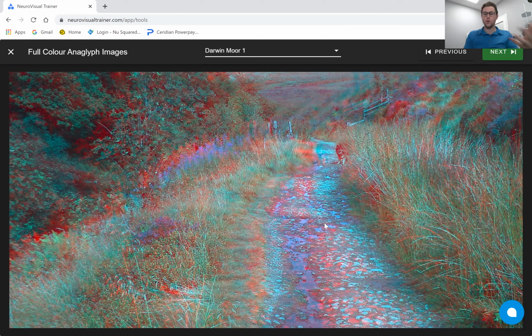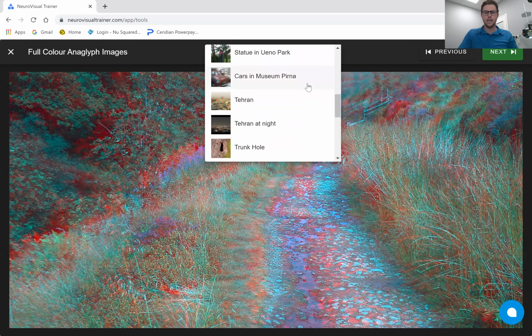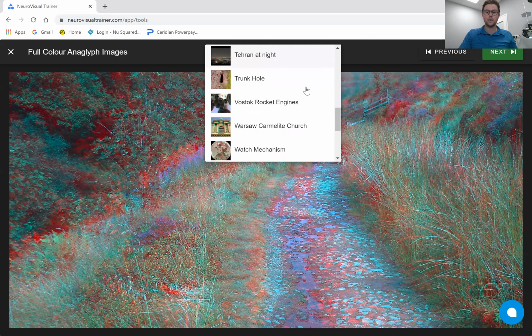What we'll often do is take this image and we can project it on a larger screen, and we might use it to teach the ability to look soft while taking in peripheral cues. And again, it's a way to just highlight the importance of the fusion between the two eyes to create the highest level of depth perception. Because you'll notice that as you're using it, it pops out more or less depending on sometimes the accommodative or focusing response. And it gives you very subtle cues, so patients will be aware of this.